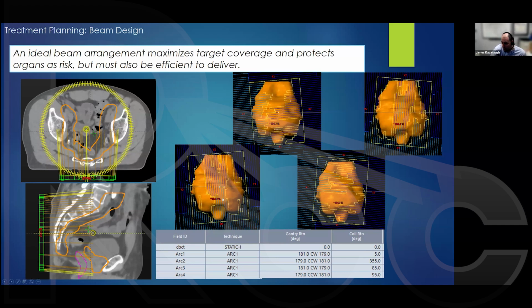One thing to note, I don't have the measurement here, but it was effectively about 16 cm sup-inf. So when you think about your beam geometry, also think about the limitations of your Linacs. This is a Varian Linac that we're planning on, so there's a bank limitation of how far MLCs can extend from the individual bank that's set at 14.5 is our rule of thumb. Because it's 14.5, we may have situations in which there's always going to be some level of opening. But for this length of target, it's going to be very close. And we also have jaw tracking, so that helps us. So we basically just kept these as full. We did not restrict the jaws in the X direction for those 90-degree angles.